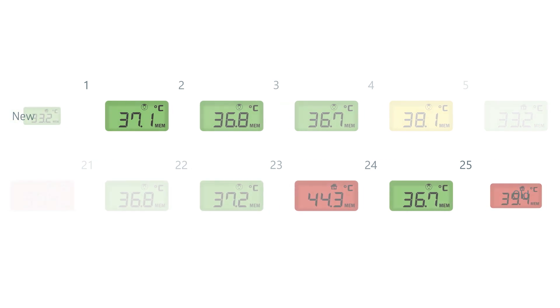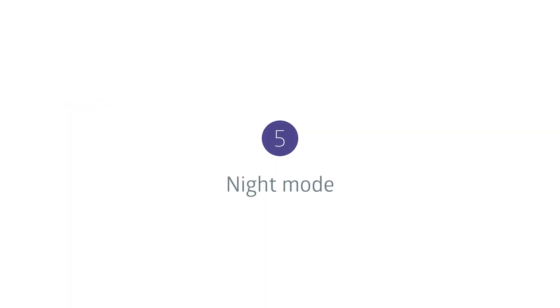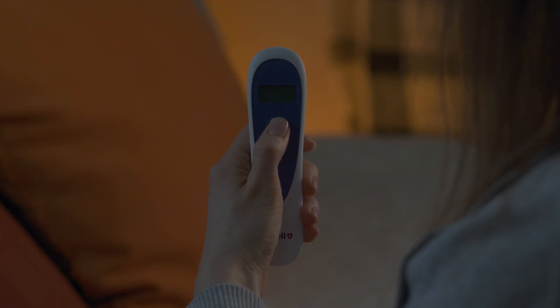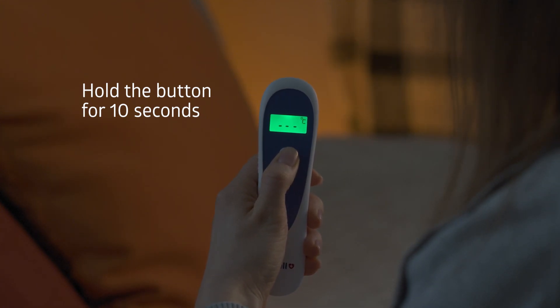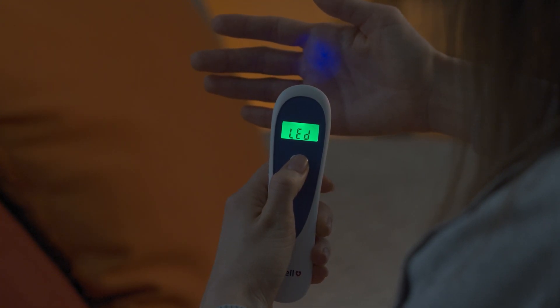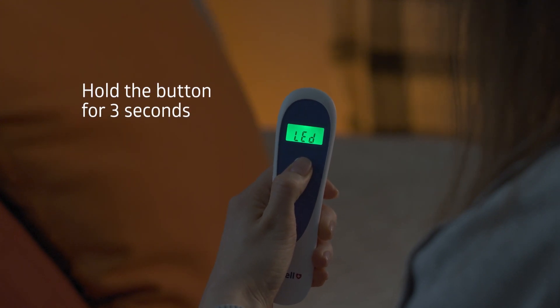Readings will be deleted one by one, starting with the oldest, regardless of whether body mode or object mode was recorded. To turn off the LED tracking light, turn off the device and press and hold the on button for 10 seconds until the device displays LED. Press the on button again to turn the tracking light on or off, then press and hold the on button for 3 seconds to save the change.